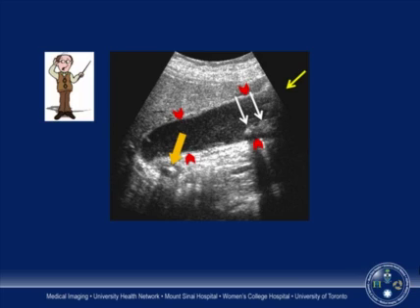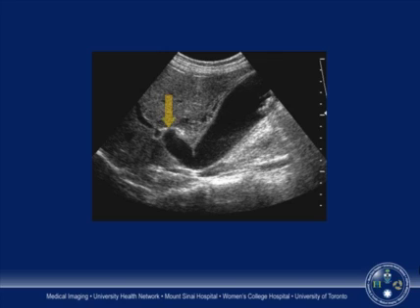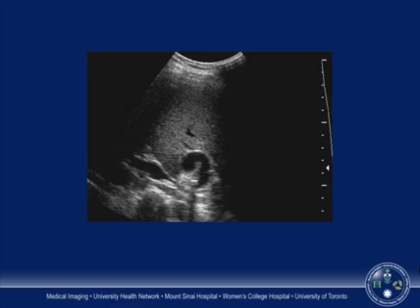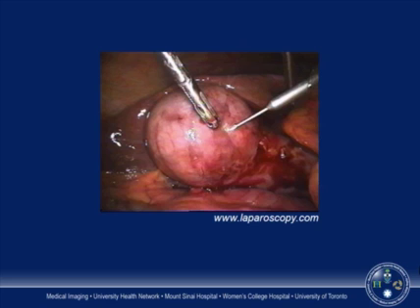Here's another example with a similar clinical history. We see stones in the gallbladder lumen, the patient was maximally tender over the sonographically localized gallbladder, and the gallbladder is tensely distended with wall thickening and an edematous gallbladder wall. Using a different acoustic window, scanning intercostally, we've unfolded the gallbladder neck and uncovered the obstructing stone. This adds confidence to the diagnosis of acute cholecystitis.